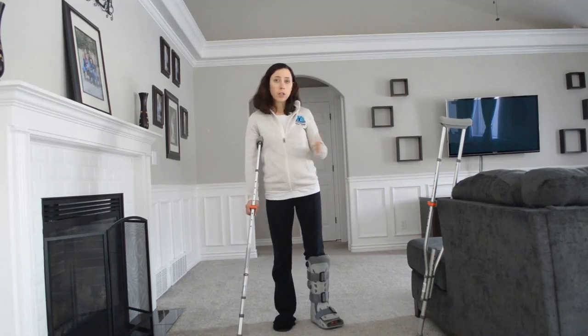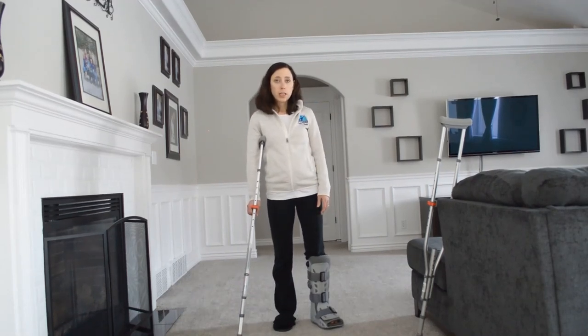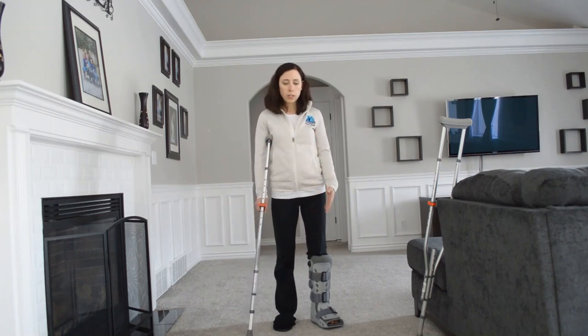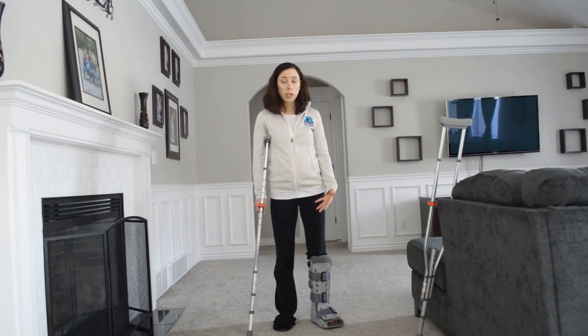Part three of the progression with crutches is progressing to one crutch. Once you're stable enough that you can stand and put weight into your foot, you're going to progress from two crutches down to one crutch.